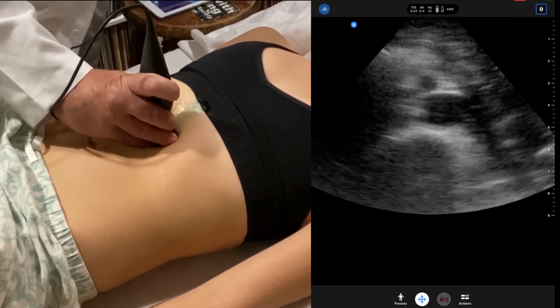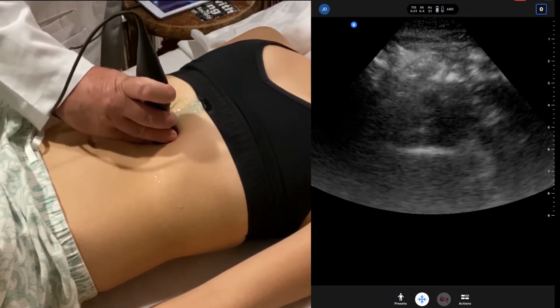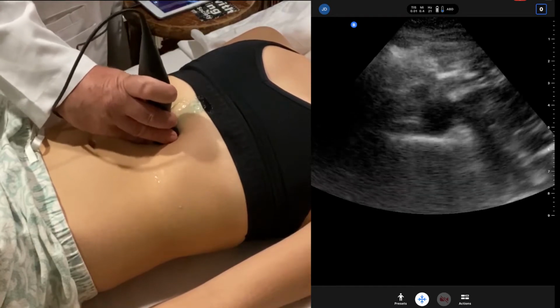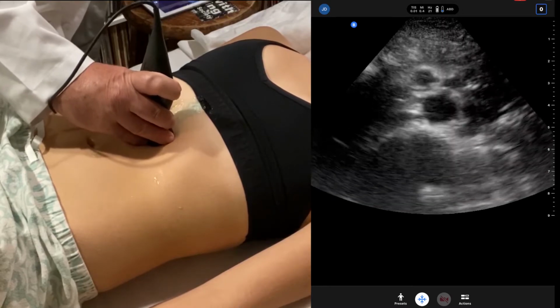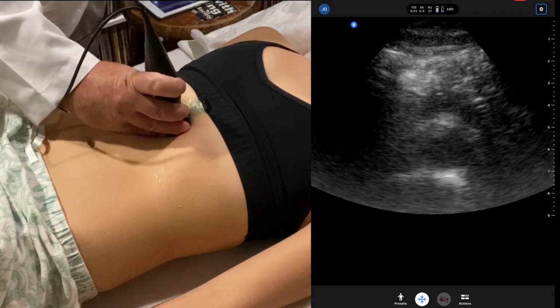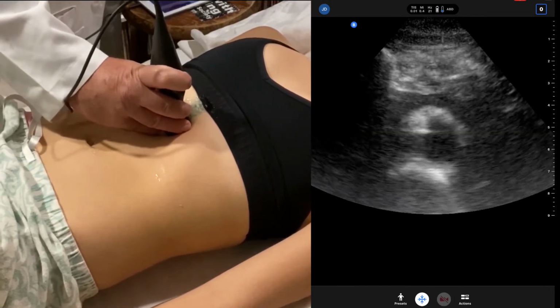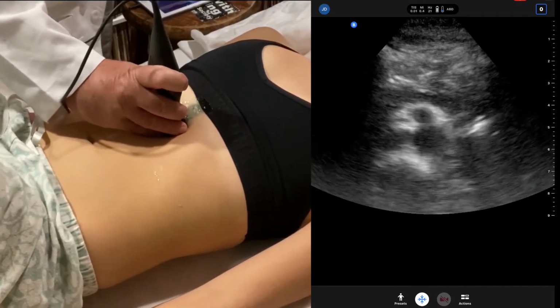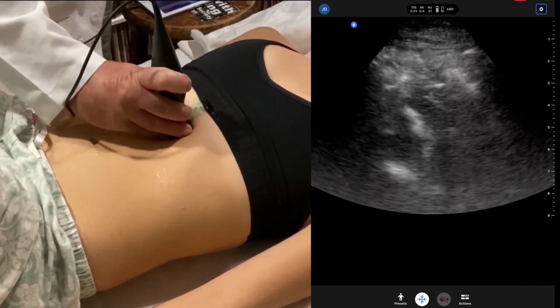And we see a little bowel gas. To relieve bowel gas, to move bowel gas in the patient, you want to apply some probe pressure, maybe jiggle to encourage peristalsis, or try a different angle. And we have a pulsatile aorta. See just a hint of that, the hepatic artery. I'm trying to get a nice seagull sign here, but at times you can't. So we're right there at that first stop.